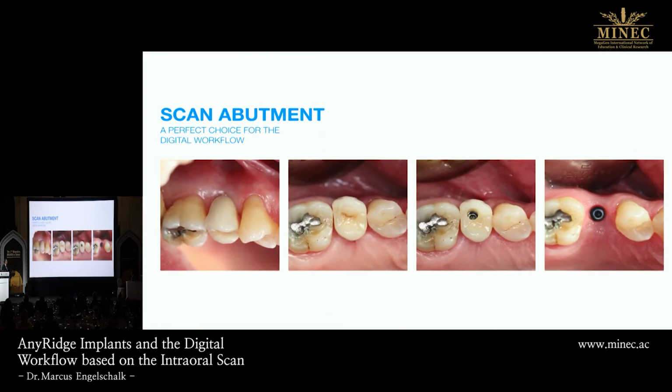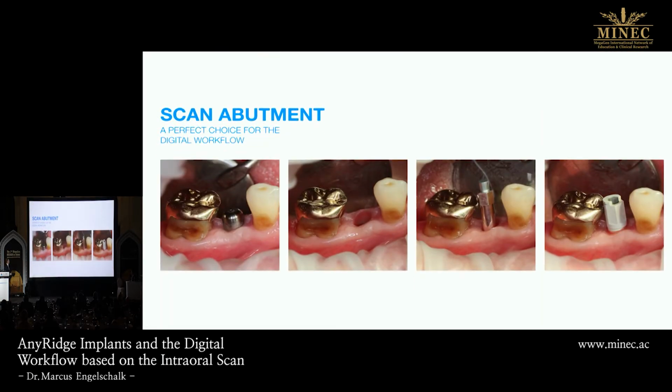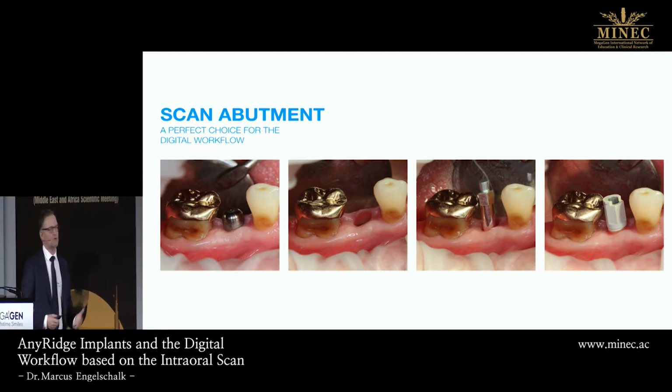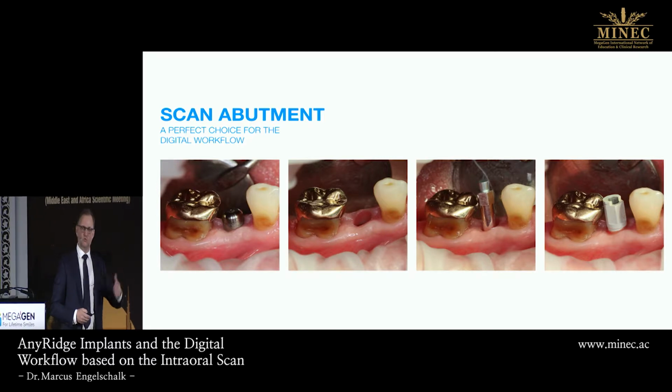Depend on you. And if you screw it, you can cover this hole, paint a little bit brown on the crowns, no problem. It's still the same, but it's digital based. It's very important. It's more precise. Or even in not so beautiful cases like this, it's a periodontal patient. So screw it out. This is the situation if you put it out. Measure. Even we do the ISQ. I can warmly recommend this to you to be sure that the implant you will use is safe.